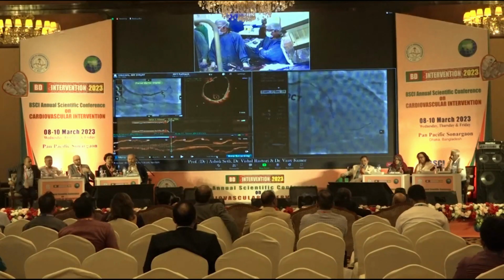You want to see whether the stent is well inflated as well as the ostium of the left circumflex or proximal part. What is your idea for doing OCT for left circumflex, Dr. Sheth?